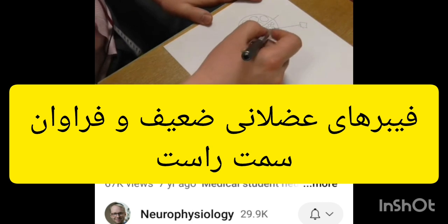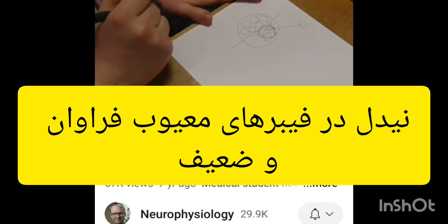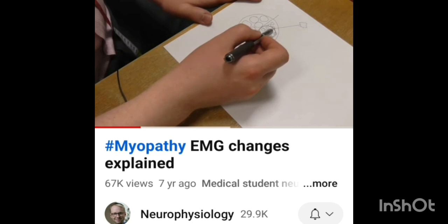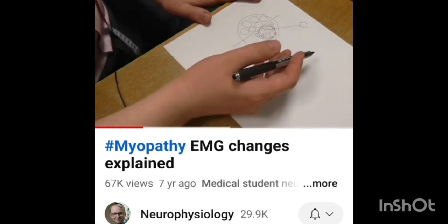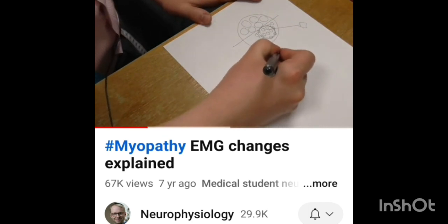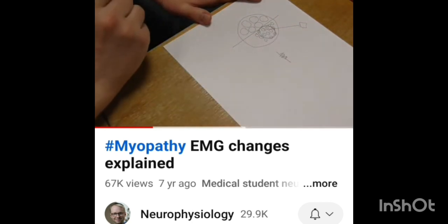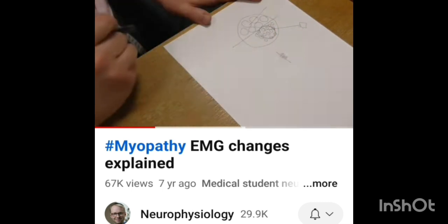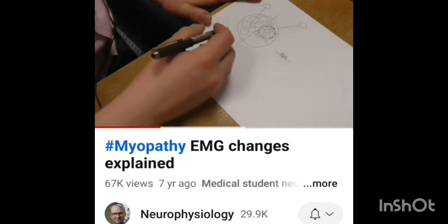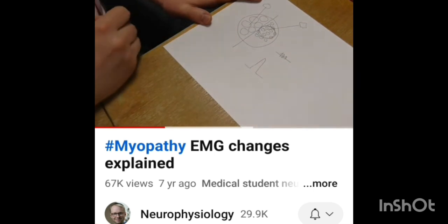In its particular field of view, it will be able to pick up lots of motor unit activity. Because the fibers are shrunken and small, they can only generate very small amounts of current. Hence, what we are going to find are small polyphasic units on our oscilloscope, so they'll look like this. This is in marked contrast to the situation in the normal muscle fibers, where we're only able to pick up a couple of motor units and they're all generating reasonable amounts of electrical activity. So that's what we would normally see.